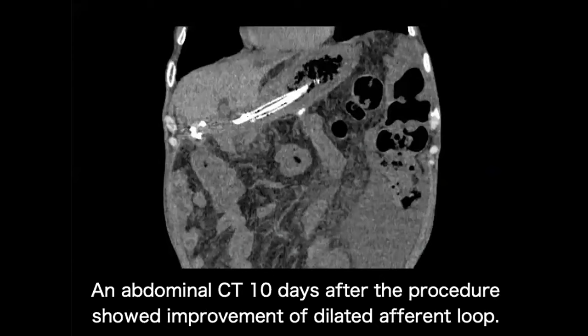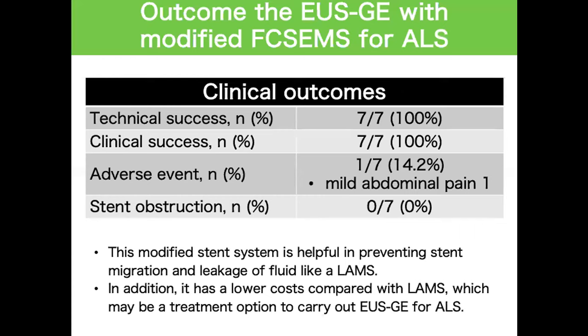The patient's symptoms rapidly disappeared. CT 10 days after the procedure showed improvement of the dilated afferent loop. We experienced 7 patients who underwent EUS-guided gastroenterostomy using a modified fully covered metal stent for afferent loop syndrome. All the patients had successful technical and clinical outcomes. One patient had mild abdominal pain, but there were no patients with stent migration or leakage of fluid. No stent dysfunction was observed during follow-up.